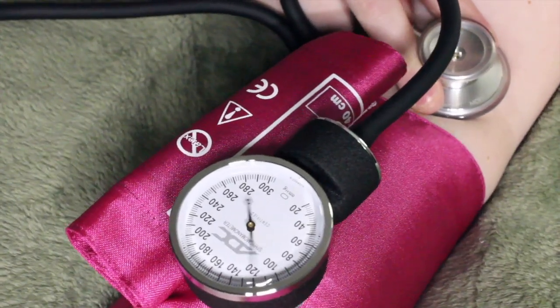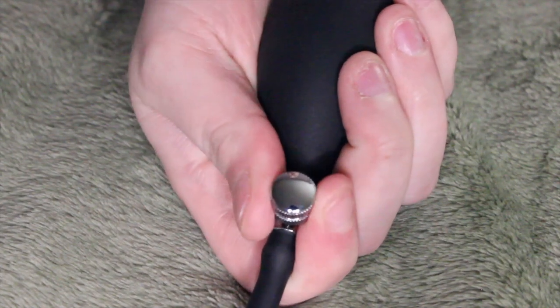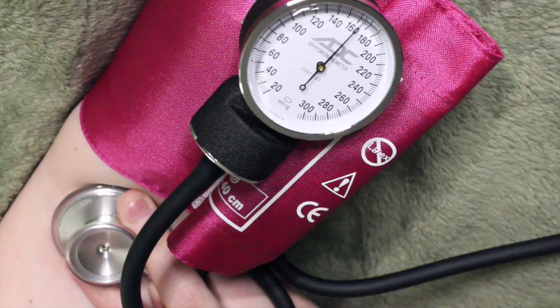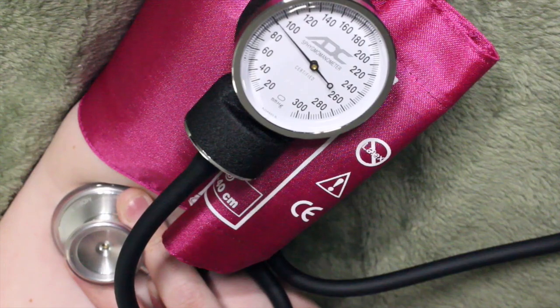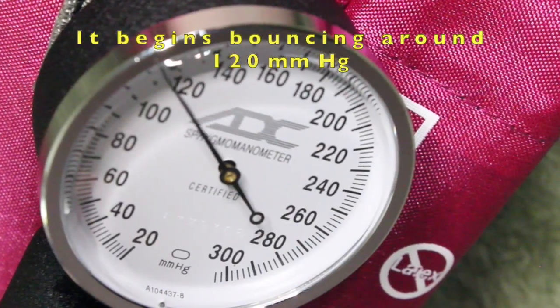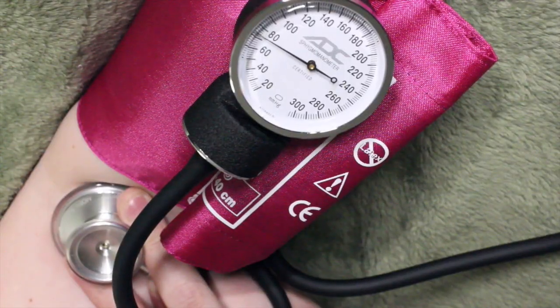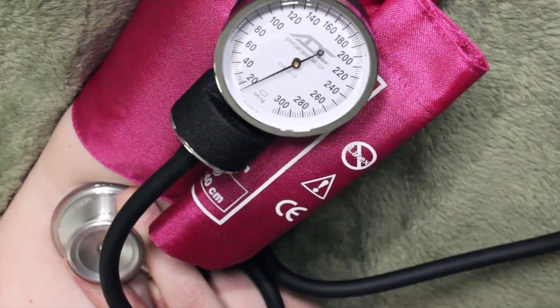I usually pump it up to about 180 or 200. Then slowly twist the release valve using your thumb and index finger while paying attention to the needle. As the needle begins to fall, watch and see where it is when you hear the first beat — make a note of that number in your head. Often times you'll see the needle begin to bounce at the first beat. Then continue listening and watching, and make a note of the number at which you hear the last beat.